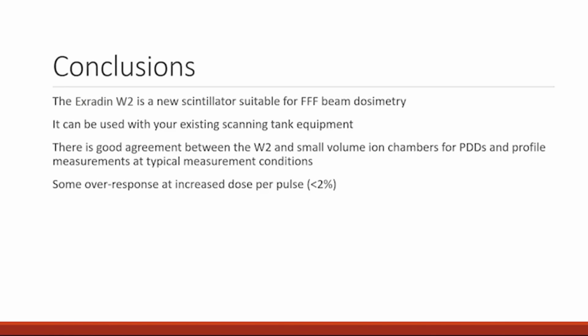That's a really good question. I don't know off the top of my head. Sure. I would expect that it would behave similarly, just because it's the electrons interacting with the plastic in either case, just like it's the electrons depositing dose in either case. But it would be a fun next project as well, if you're looking for more projects, I guess.